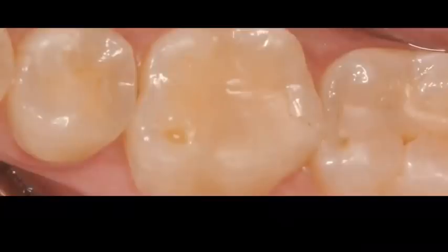So I'm sharing with you this case and this composite was placed in this patient by a different provider, maybe a year before I saw this patient. And when I look at composites a year after they've been placed, and you see this amount of wear, you have to start thinking about, okay, what's happening with this restorative material, what's happening with this restoration that is having so much wear on this posterior tooth. And again, look how flat the restoration appears to be.